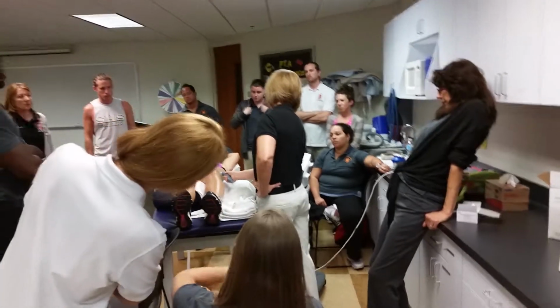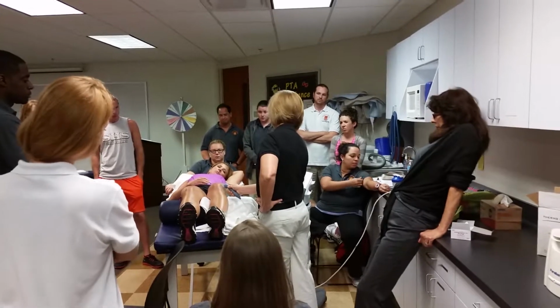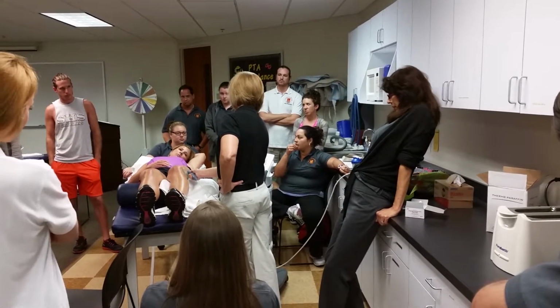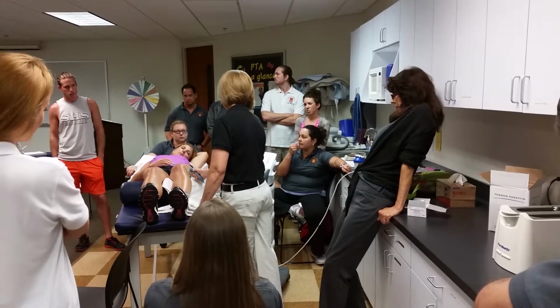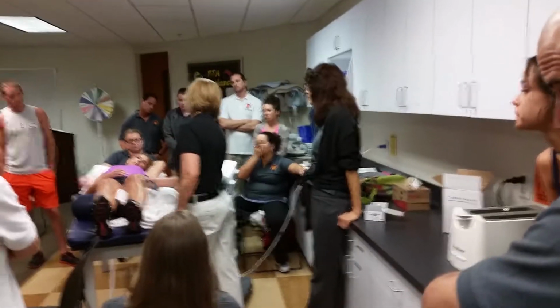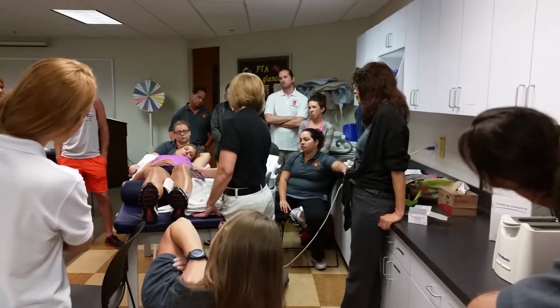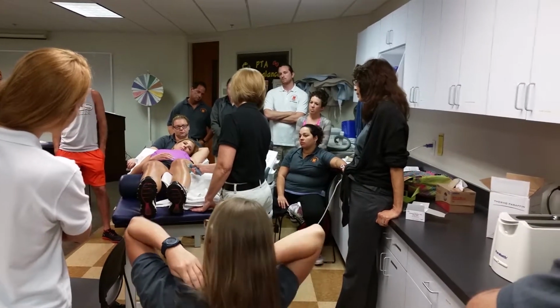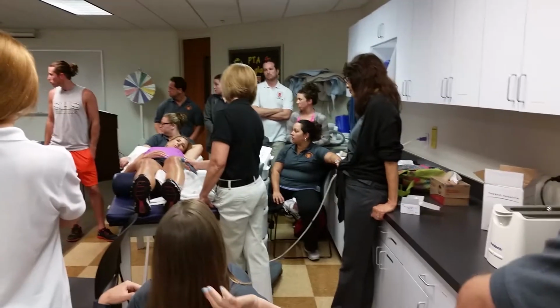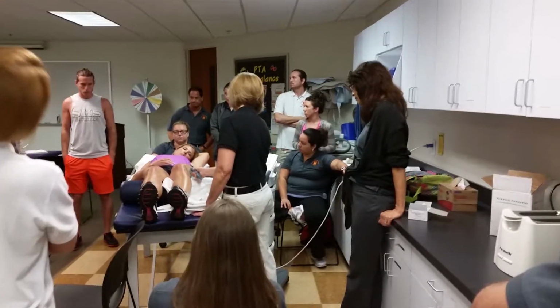So you want to make sure you're moving the sound head to the contour of the tissues. If the tissues are rounding up on the top of my treatment area, I want to make sure that I get to those areas. Don't go straight like this and come off. A lot of people will do that. You have to follow the contours of the tissues, because remember, things are reflected, refracted, and attenuated. We want to enhance absorption, not refraction and reflection.